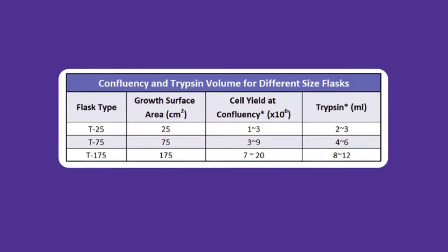Normally use 5 ml trypsin for T75 flask. This volume can be scaled up or down according to size and the surface area of the vessel.